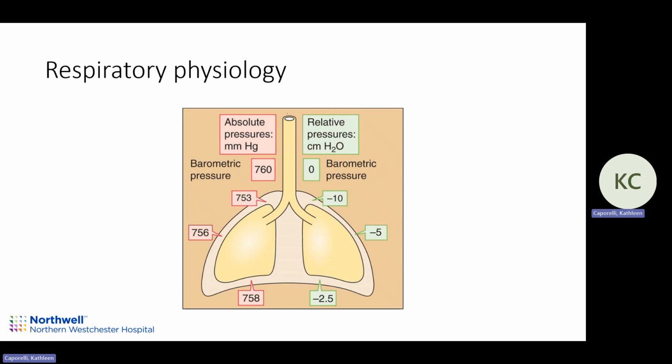Think about the old iron lungs for polio. That's sort of how we breathe physiologically: we expand our chest, and that sucks air in. Positive pressure ventilation is different. When we put somebody on CPAP or intubate them, we're forcing air in, and so the physiology is a little bit different for how we breathe while we're on a ventilator, CPAP, or BiPAP. Okay.